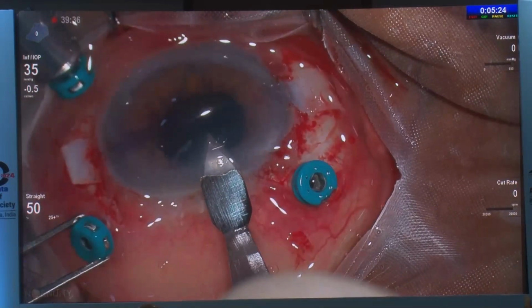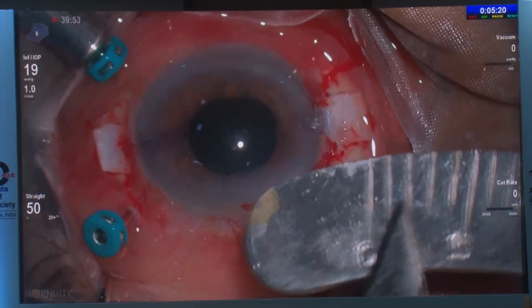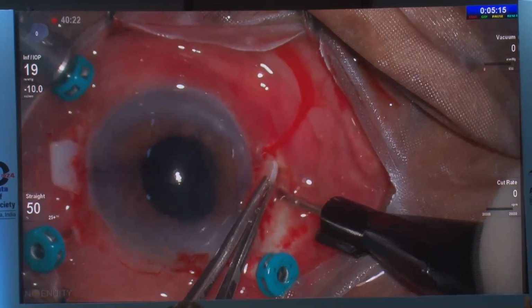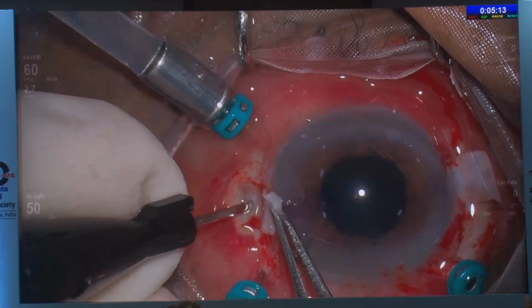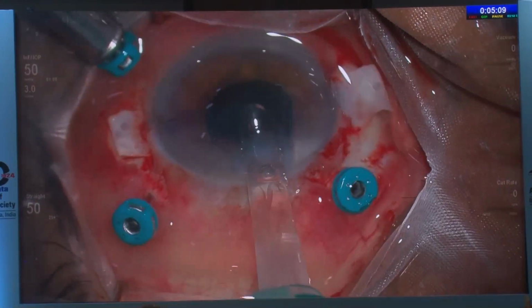A 2.8 millimeter incision is made. Scleral flaps are made, and 1.5 millimeters through that we make a 23 gauge entry. Some people are doing 25 gauge entries also, and they say those are also working. We do 23 gauge and it has worked well.